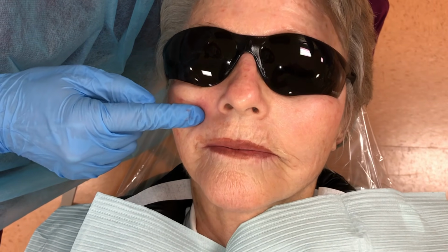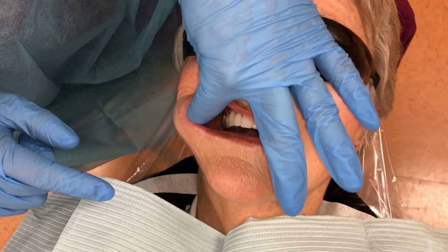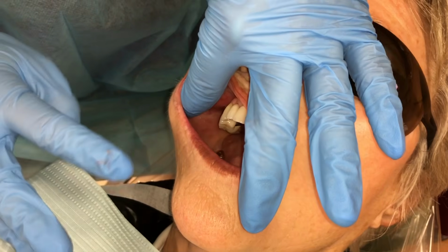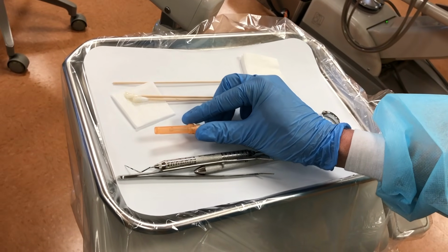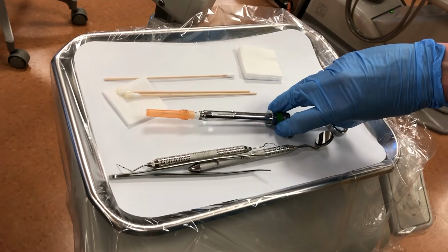Replace the patient's goggles and repalpate for the sensation. Cover the foramen and retract carefully to view the penetration site. Have the patient open slightly so that you can identify the penetration location. Uncap the needle with a single hand. Note bevel and window placement is correct.